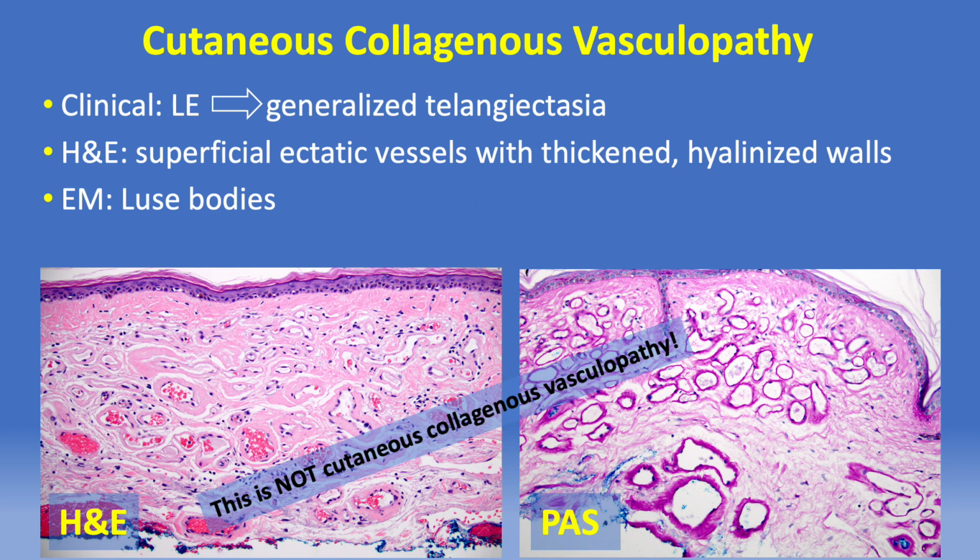Full disclosure, the images that I'm showing here for illustrative purposes are not those of clinically confirmed cutaneous collagenous vasculopathy, but are shown here simply to depict the thickened hyalinized vessel walls that can be highlighted by the PAS stain.